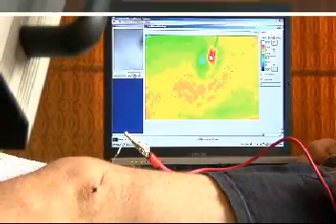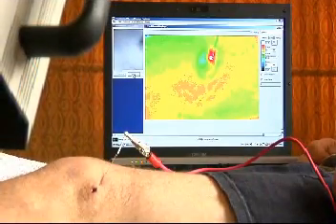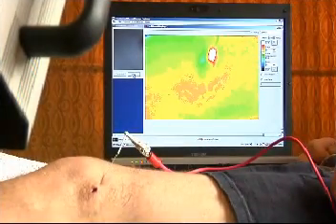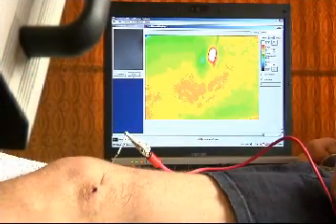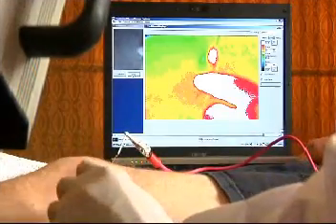You can see where my finger is. This is where we want it. This blue spot here is still cold from the tumor that hasn't been heated yet. We'll heat it again. We'll do so we can get this part of the tumor. We're going to move the probe.